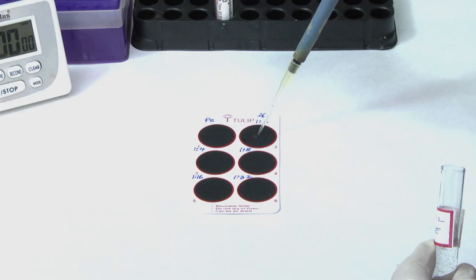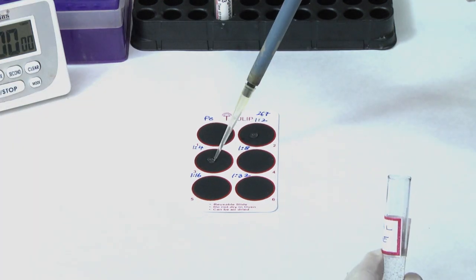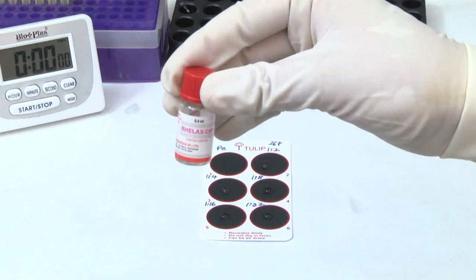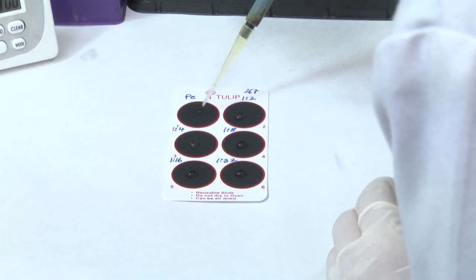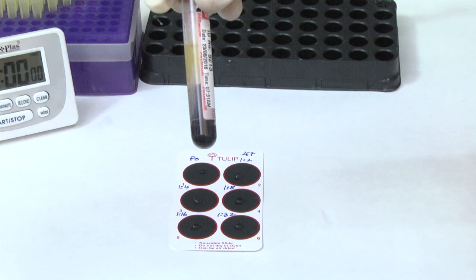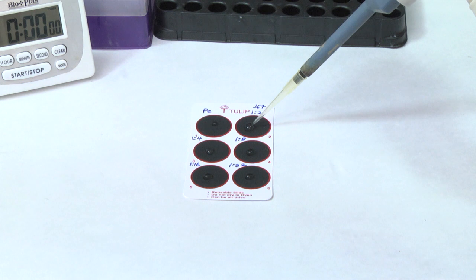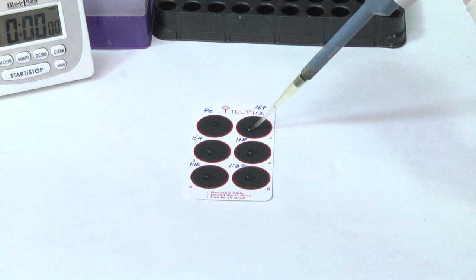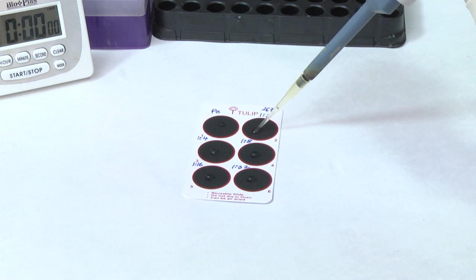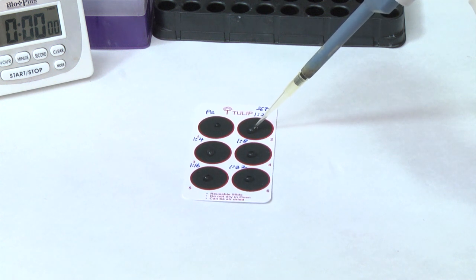Place 50 microliters of 0.9% saline in circles numbered 2 through 6. Place 1 drop of positive control on reaction circle 1. Place 50 microliters of serum in circle 2. Mix the saline and the serum in circle 2 by drawing the mixture up and down. This gives 1 in 2 dilution.